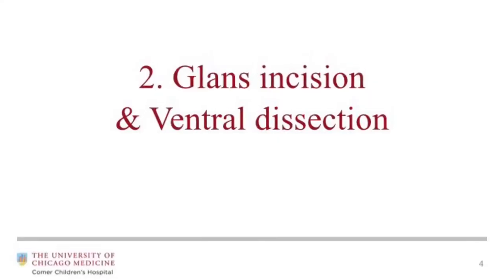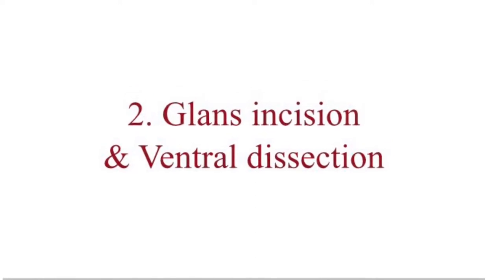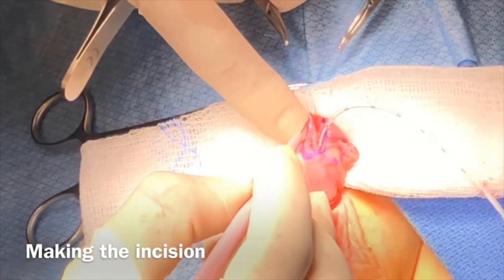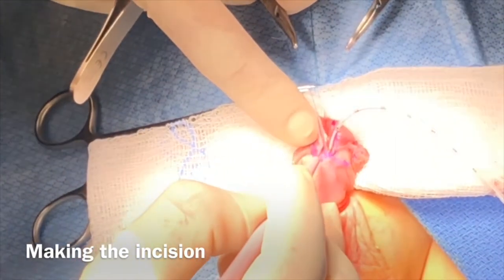The urethral plate on the glans is incised using a sharp ophthalmic eye knife.